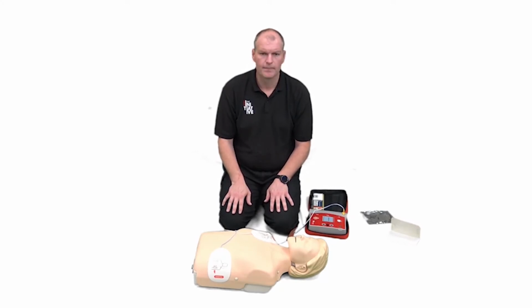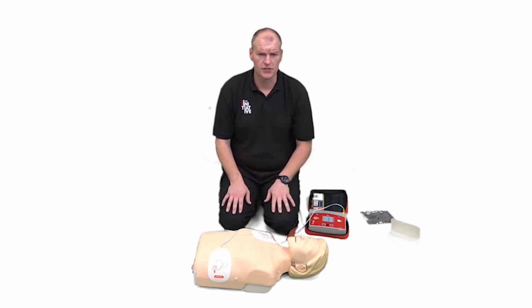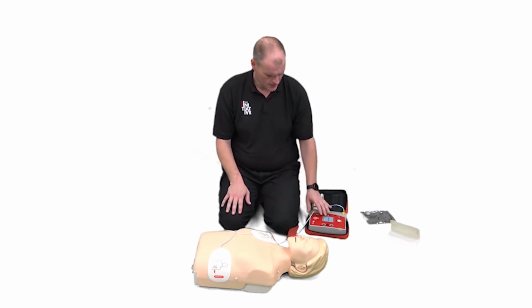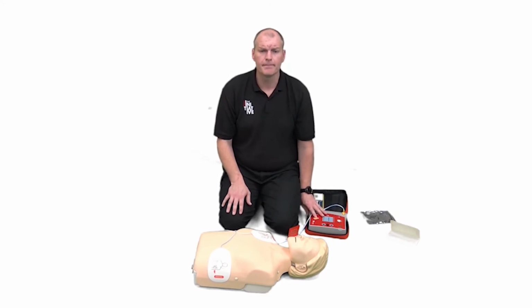Analyzing heart rhythm. Do not touch the patient. So make sure all CPR is stopped right now so that it can get an accurate analysis of what's going on within the casualty's heart. Shock advised. Charging. Stay clear of patient. Deliver shock now. So press the orange button now.